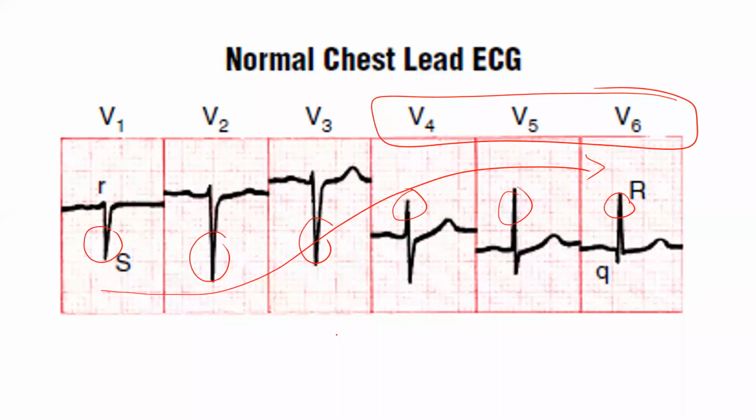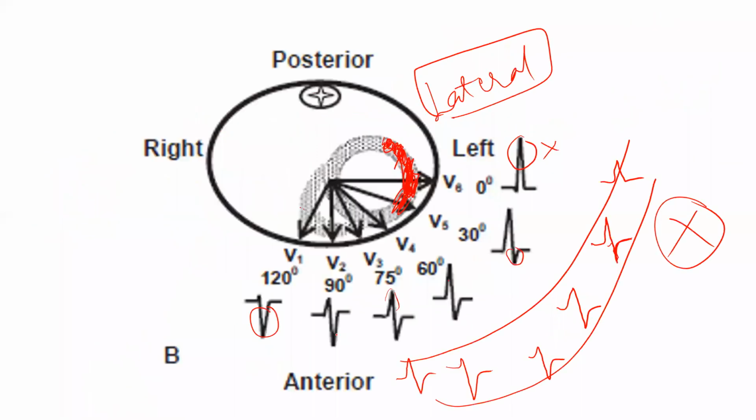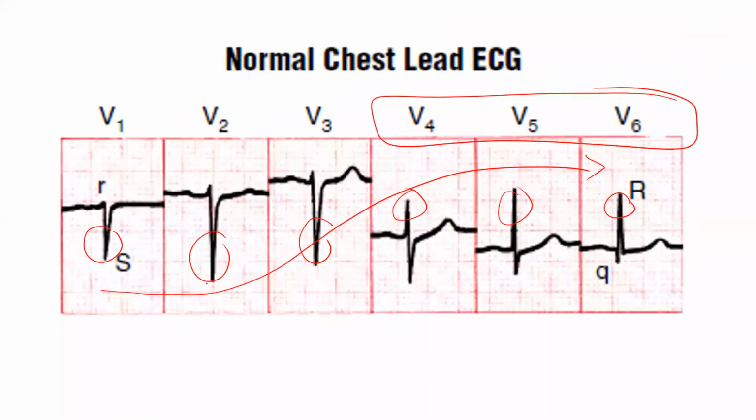Something like that, the ECGs are also. You will understand so many times when you are seeing some diagrams like this. This is the graphical representation. You will see, oh, so nicely the waves are visible. But in reality, when you see the ECGs, it won't be like that. Okay. So this is the ECG. And this is the point which we call the transition of the waves.